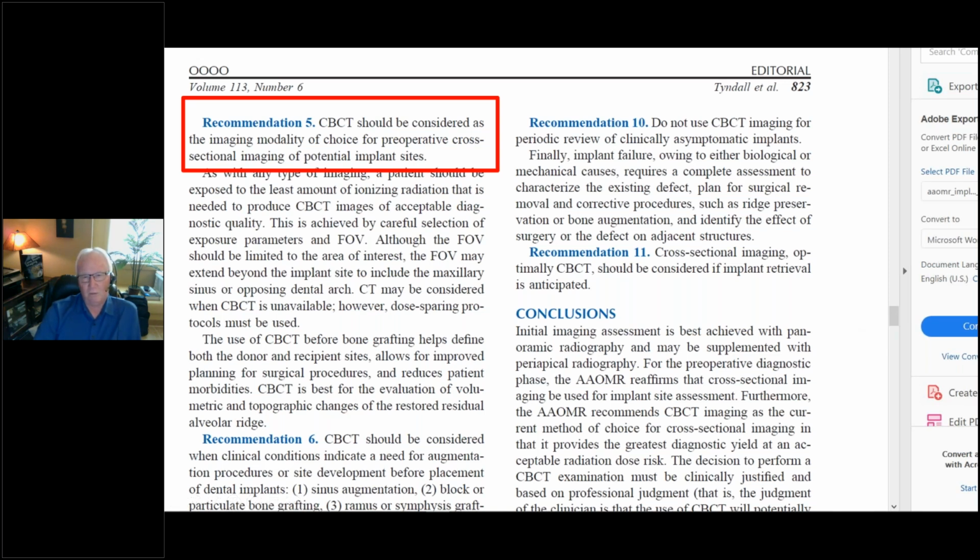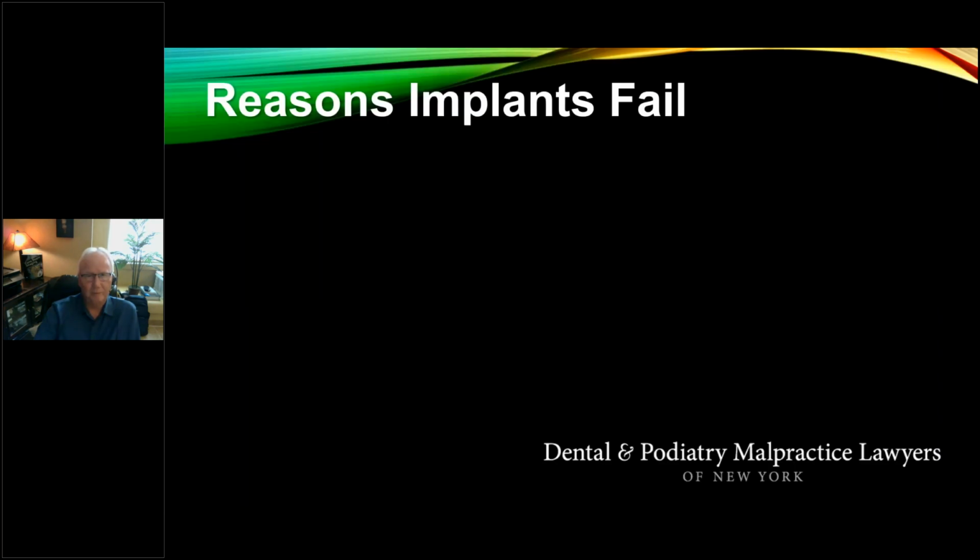And I do a lot of expert witness things, and I've had 2 or 3 cases of implants where they shouldn't have been, and they're ongoing as we speak. But if you have the right technology or access to it, and you use an implant planning program and a surgical guide, you won't be able to go wrong.